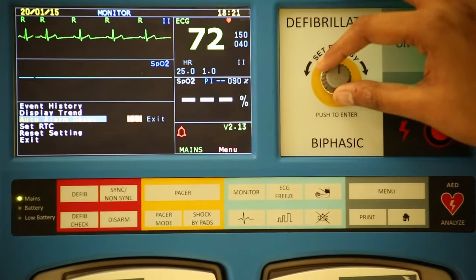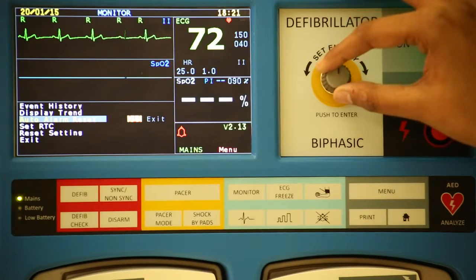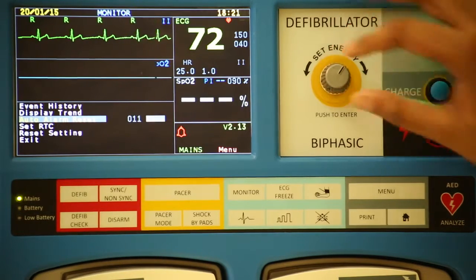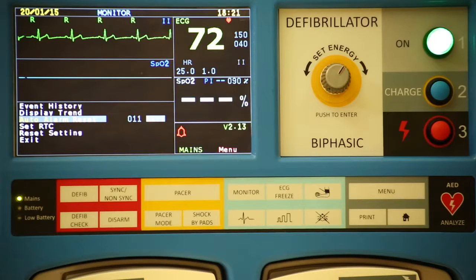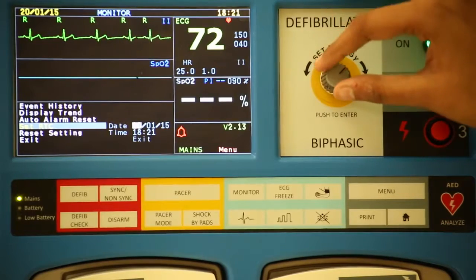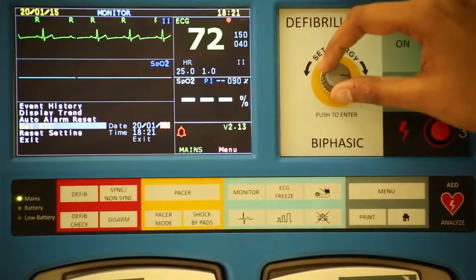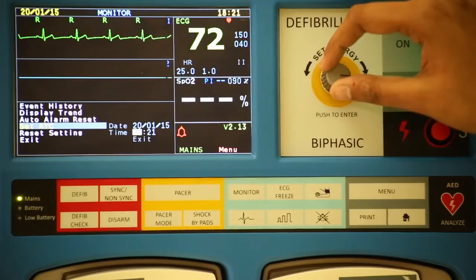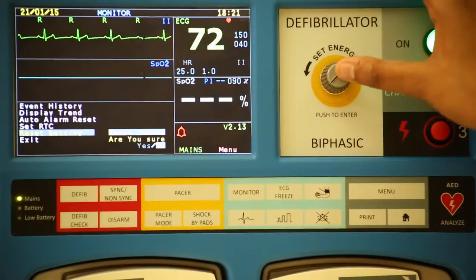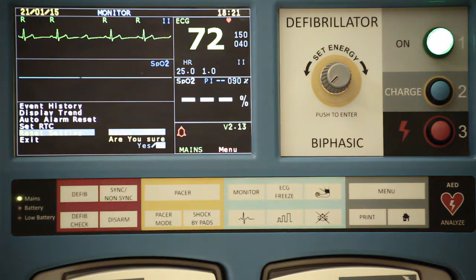Auto Alarm Reset helps you to reset the required time interval for an auto alarm. When the master alarm is off, it gets switched on automatically after set time interval. You can set the real-time clock by clicking on Set RTC. Reset Setting button resets all the settings of the unit to default values.